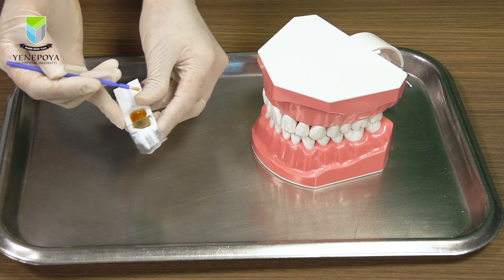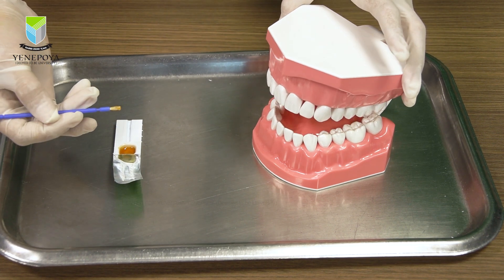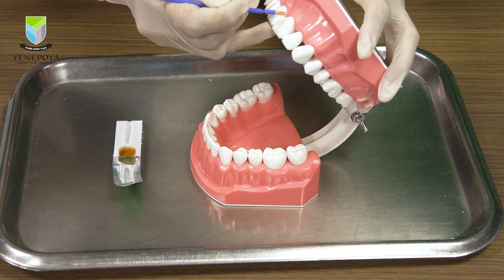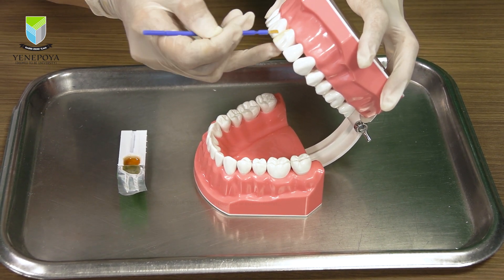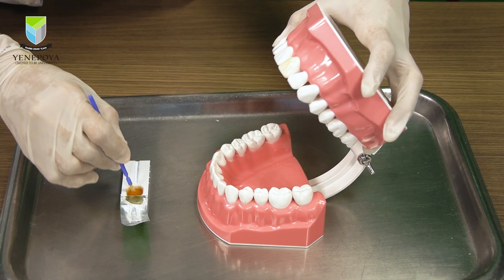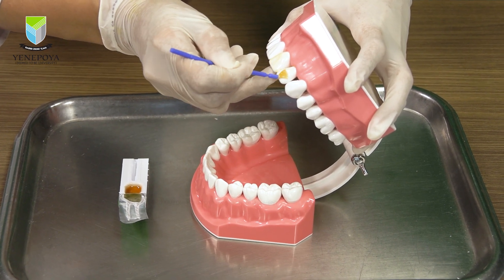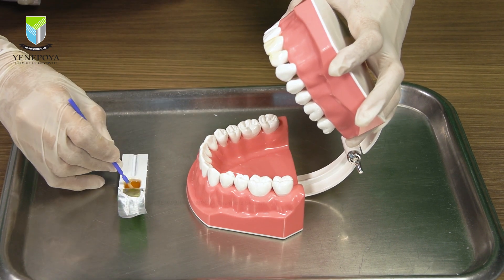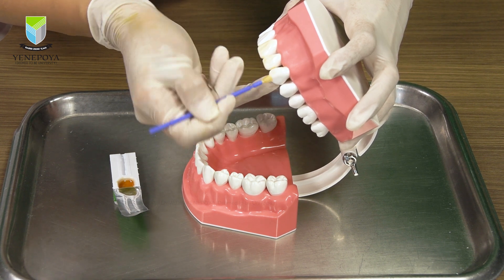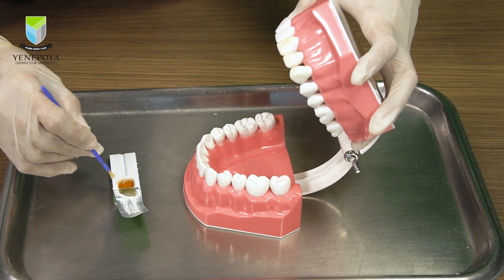Here is a close-up of the application technique for better clarity. Take a small amount of varnish on your brush as demonstrated earlier, and starting from the margin brush it down using two to three strokes to cover the entire surface. The number of strokes may vary depending on the size and location of the tooth. Deciduous or anterior teeth will naturally require fewer strokes than permanent or posterior. Use your finger to act as a fulcrum for stability, and that way chances of unwanted application on the lip can be avoided by restricting the movement.